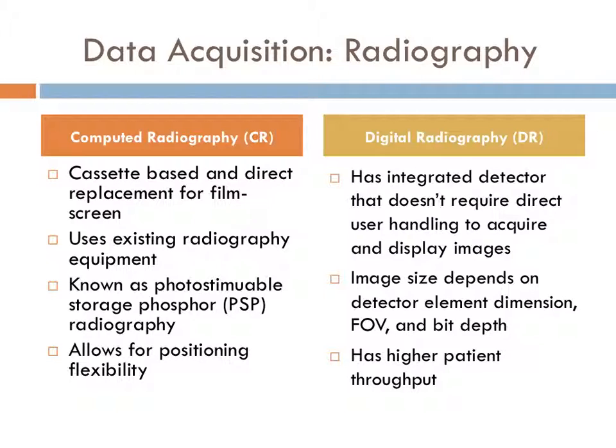The bad thing about the good side of digital radiography, so it's nice that it has a higher patient throughput, but what you're seeing nowadays is that it often eliminates the need to replace techs. So it is so efficient that it actually allows the department to run on a lower staff level sometimes.